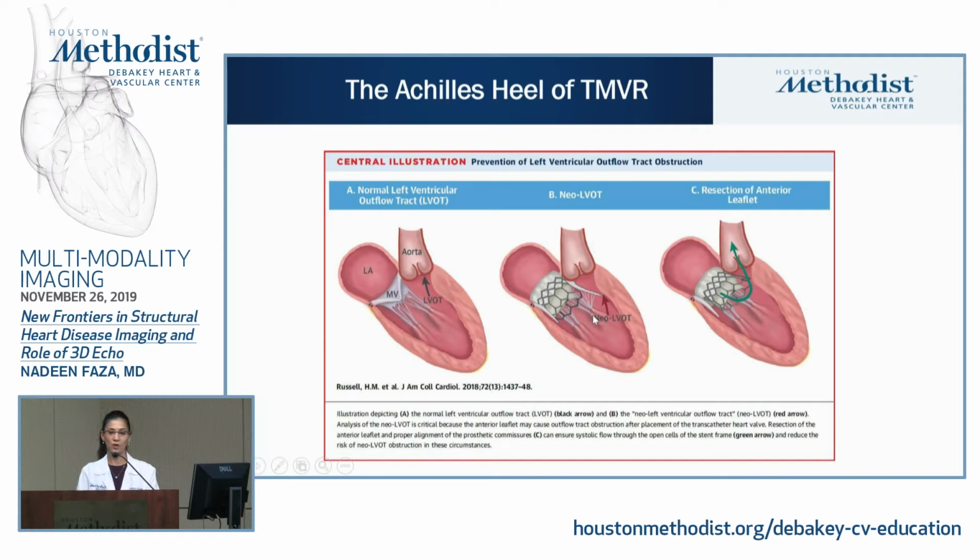But this is something to watch for, especially when you're reading the echoes post-TMVR. Look at the LVOT signals, look at the gradients across the LVOT to make sure there's no evidence of LVOT obstruction.